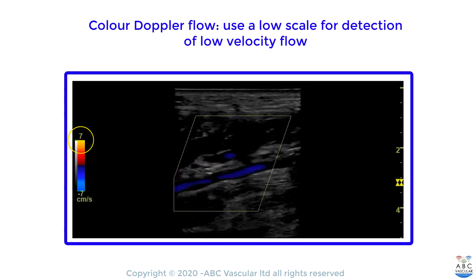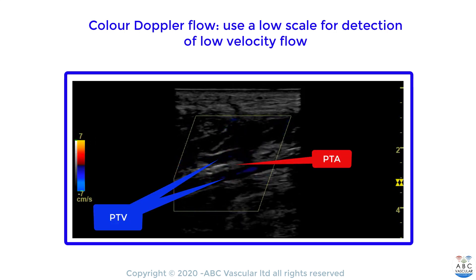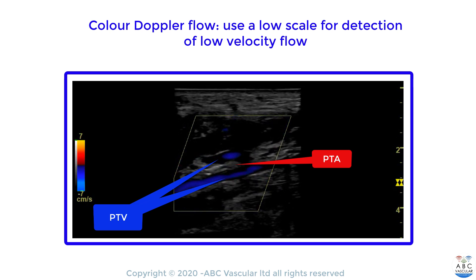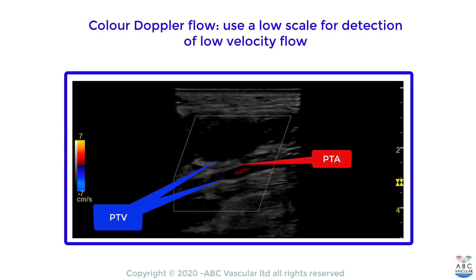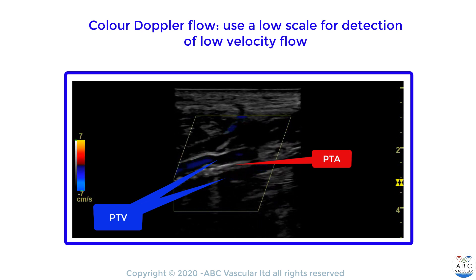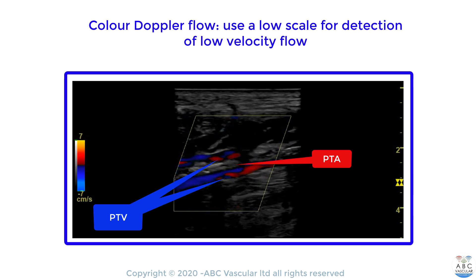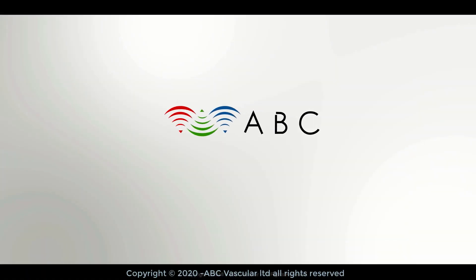As shown in this video, while there is color doppler flow filling the satellite posterior tibial veins, there is no color doppler flow within the posterior tibial artery, confirming the presence of an arterial occlusion. Thanks for joining ABC vascular ultrasound.